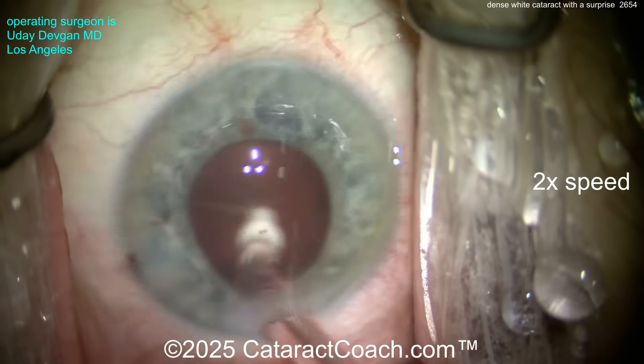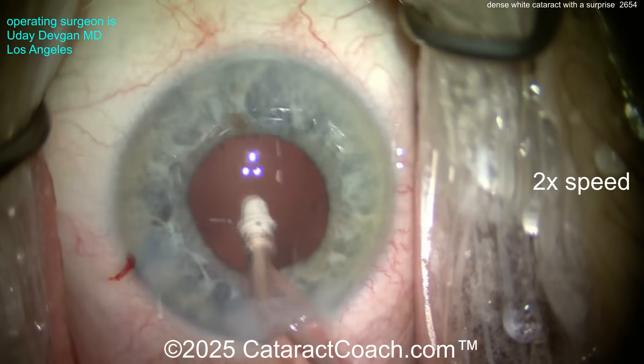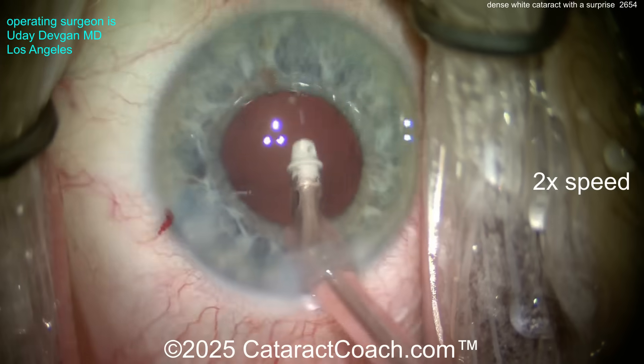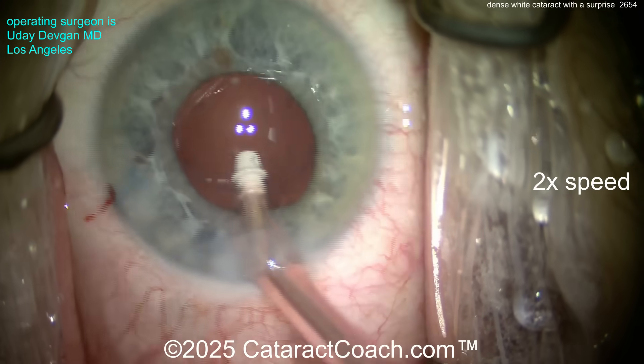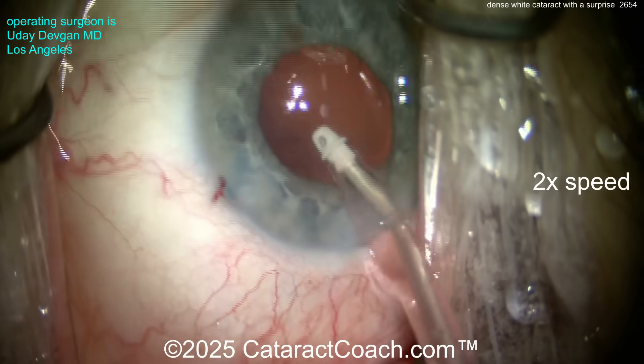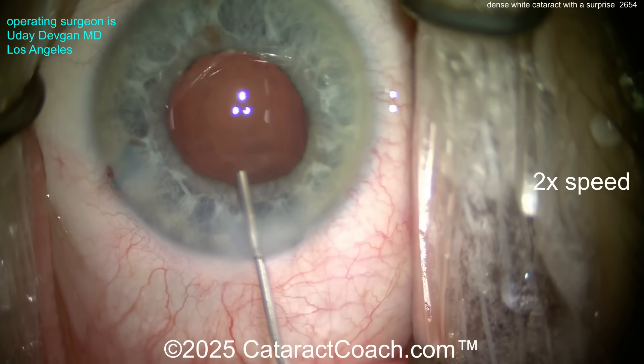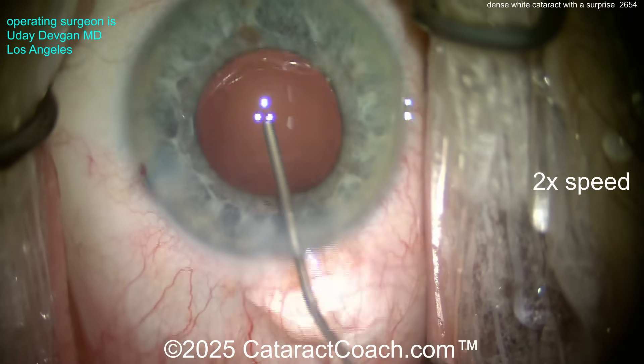Cleaning up the cortex — it all looks pretty good. Don't aspirate the iris. We should probably lift up that iris to check. Why don't we put the lens in first, and then when the eye is full of viscoelastic we can lift that iris and check — and that's where we're going to find the other surprise.